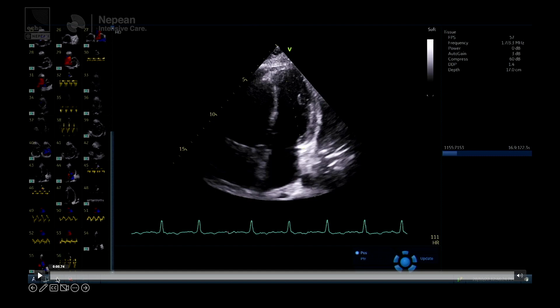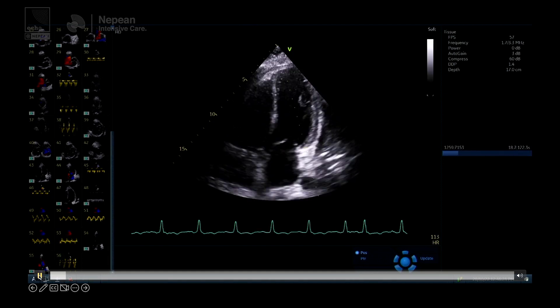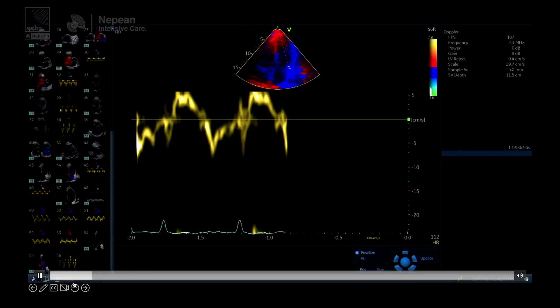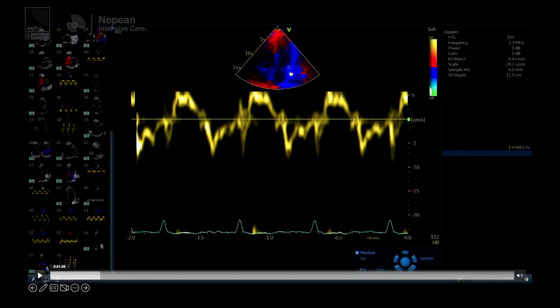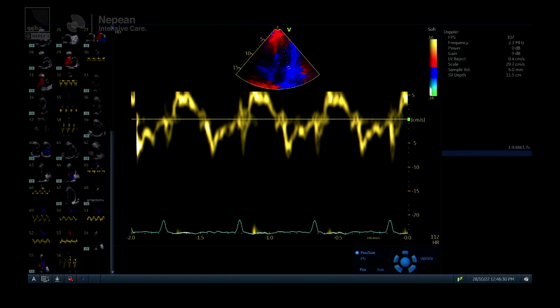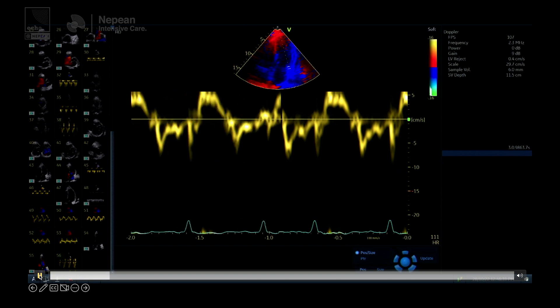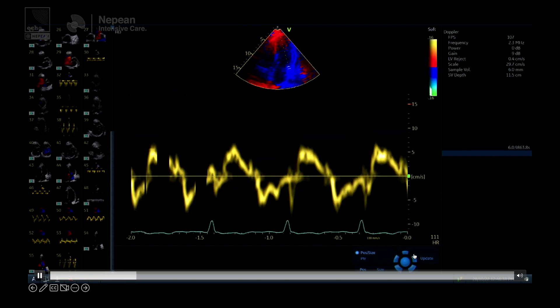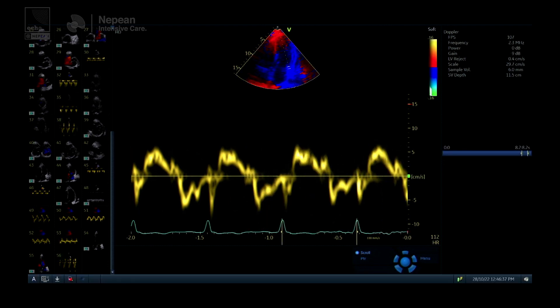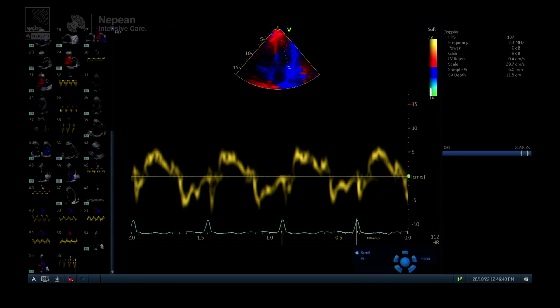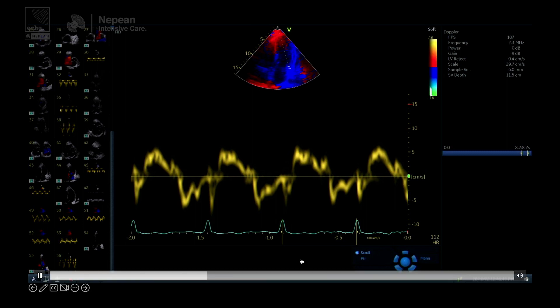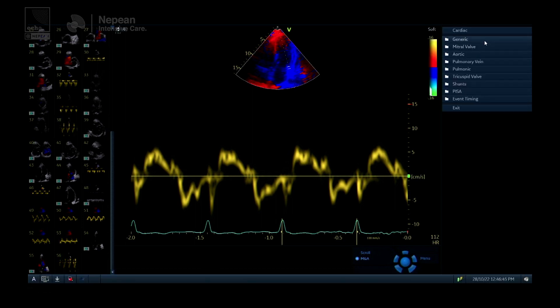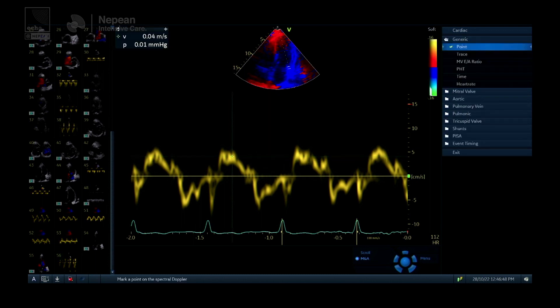Let's look at how to do it. This is an apical four-chamber view. We're putting the tissue Doppler on — you can see the colors that appear on the image when we apply the low pass filter, which immediately gives a spectral Doppler trace. We need to do a few things to optimize it: lower the baseline and turn the gain down slightly. We're then going to take the S prime measurement.